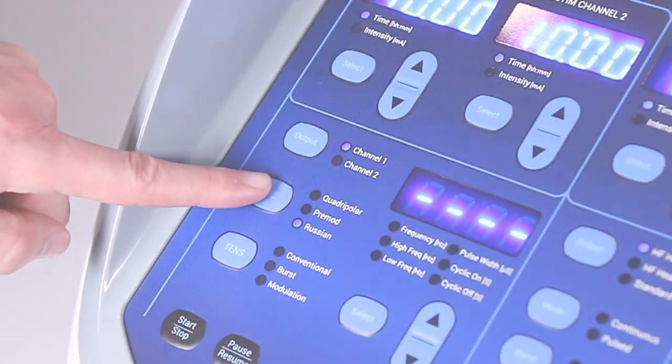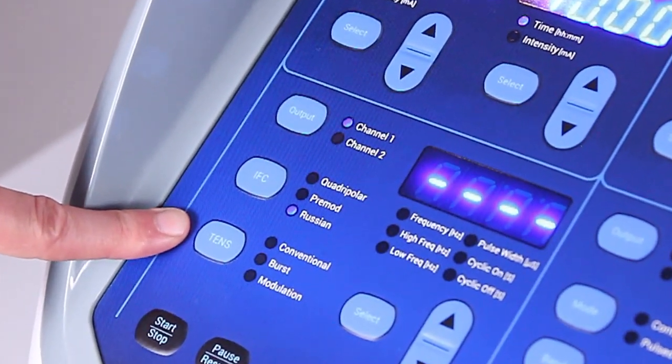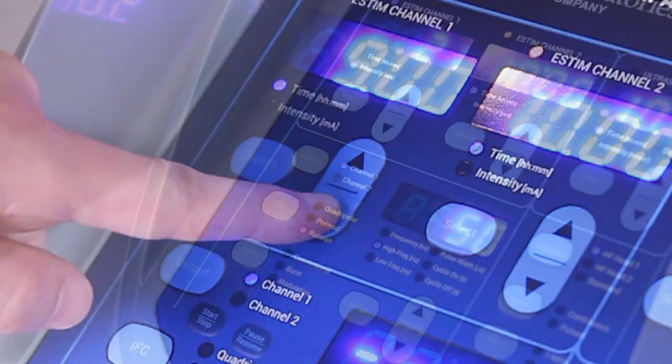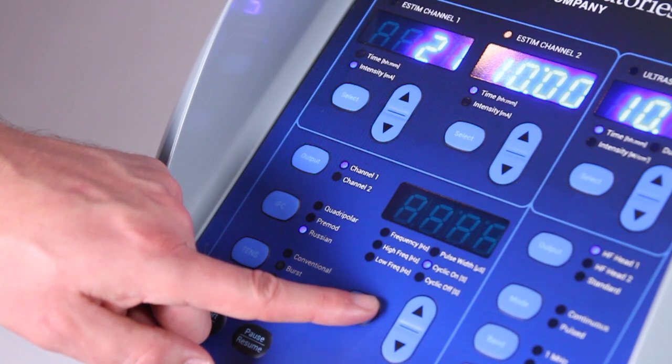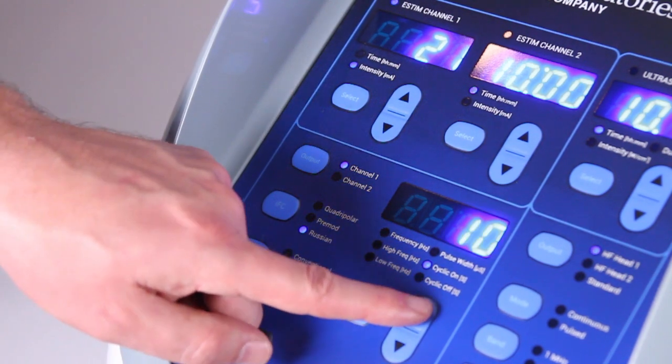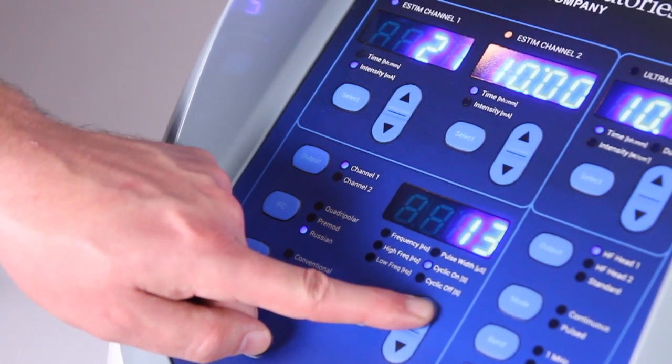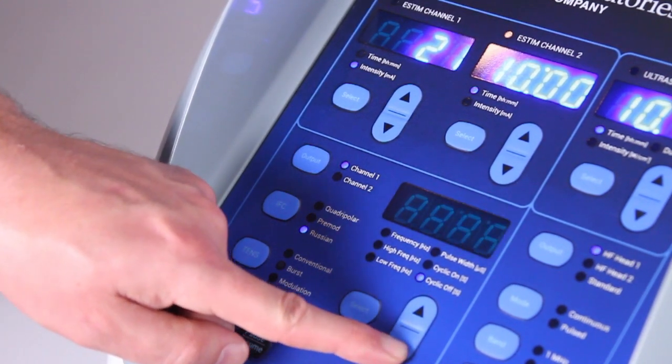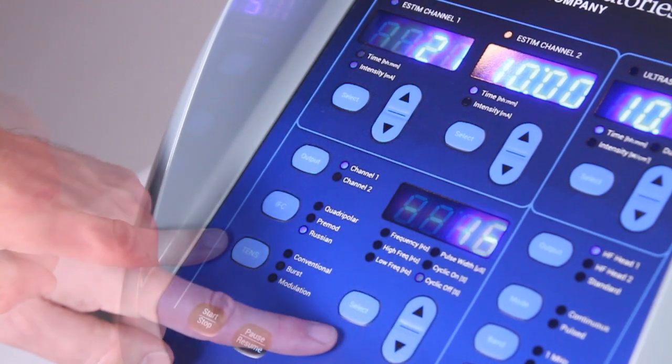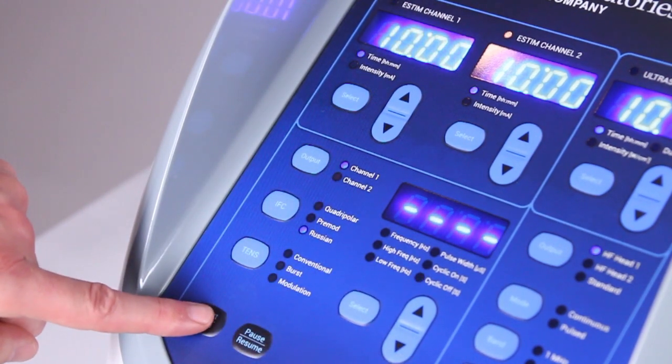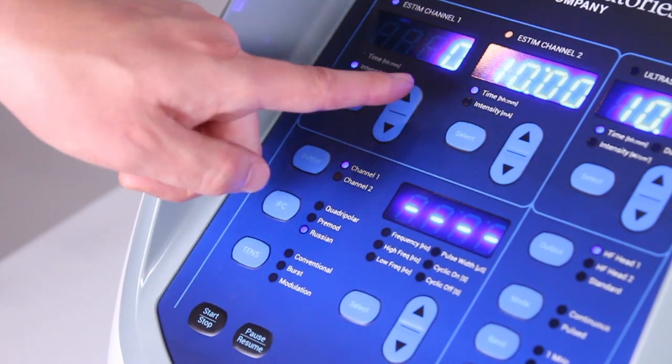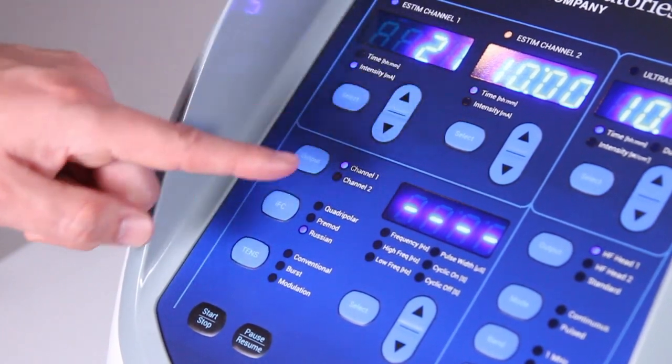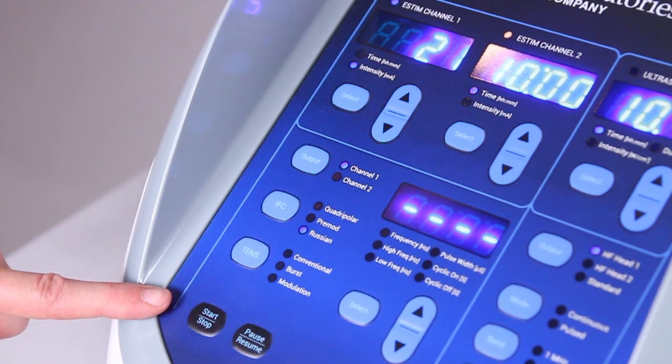Press the IFC button again to select Russian. Use the up and down arrows to set the time. Now use the select button in the center to select cyclic on and choose from 0 to 30 seconds. Press the select button again to choose cyclic off and set your time in the same way. Press start stop to begin the treatment. Use the arrows above to set the treatment intensity. Russian may be used on channel one and channel two with different settings at the same time.